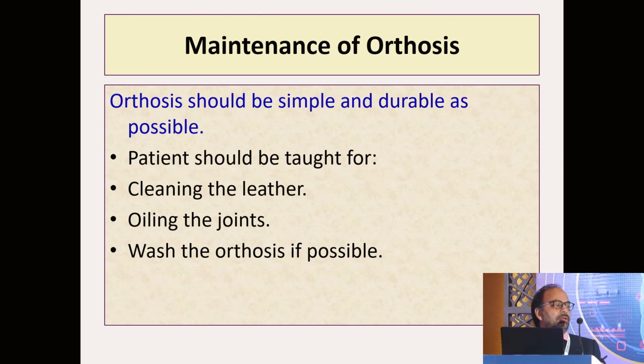What are the points to be remembered for maintenance of orthosis? Patients should be taught to clean the leather, oil the joints, and wash the orthosis if it is possible. All orthoses should not be washed.